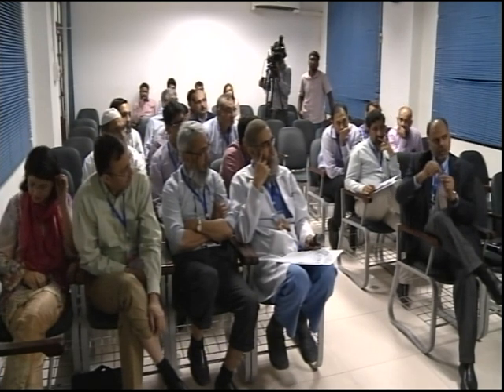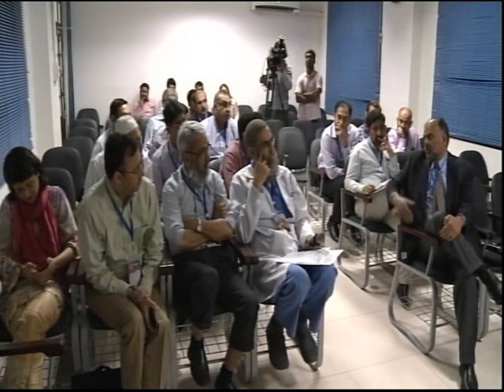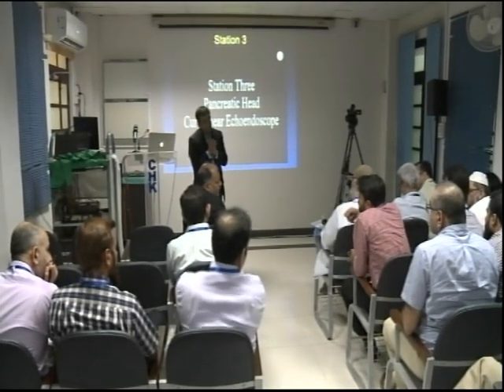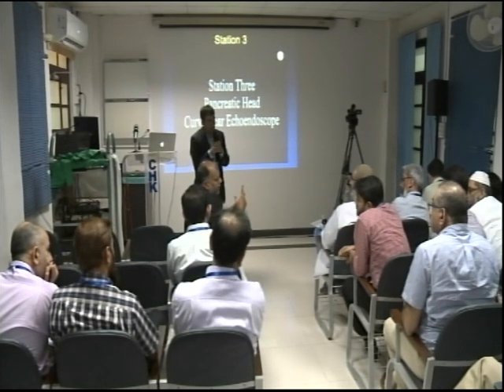It's got a sharp edge as well. So those of you using this will have difficulty getting into the duodenum. As a beginner, we started to find out the structure in the stomach, because we have a difficulty with Pentax in going into the duodenum. Pentax has a big bending section.